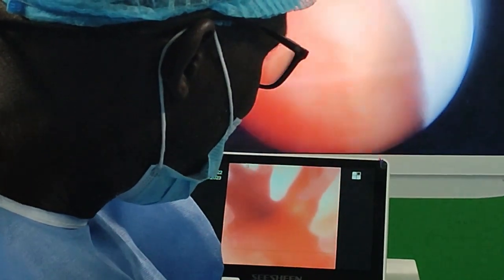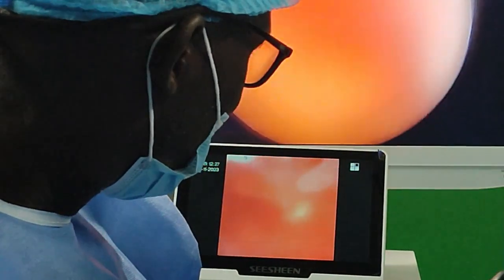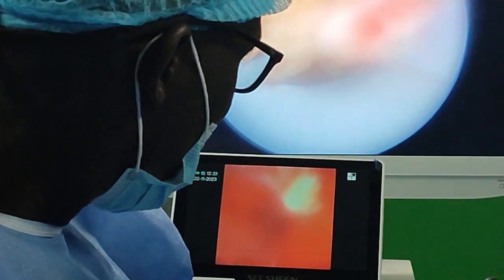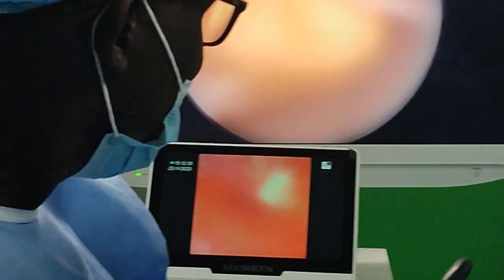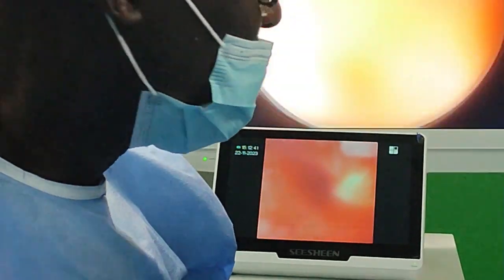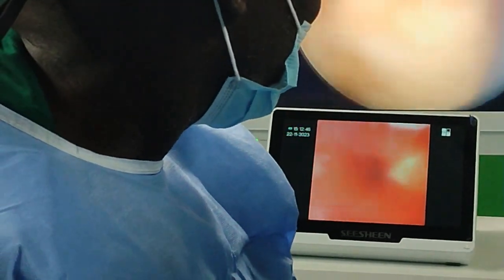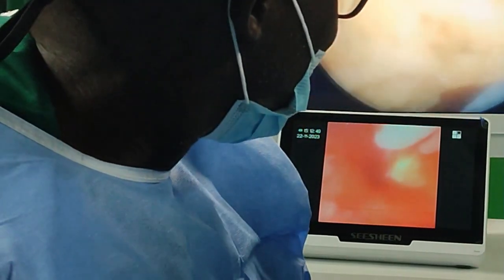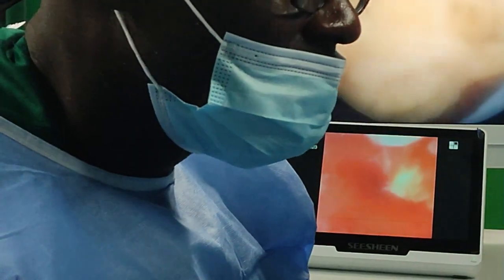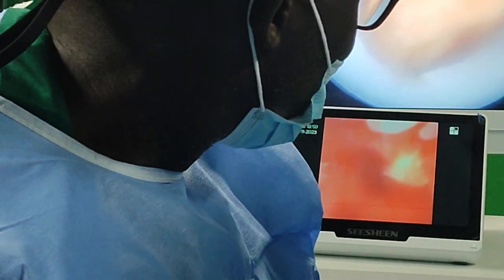Yes, that's my invitation. I'm busy. Laser, please. It's for him. I just go down to the... Let's see if you can get it. That is still there. Yes. So I'm seeing it. Are you still using the 550? Yes, 550 now.